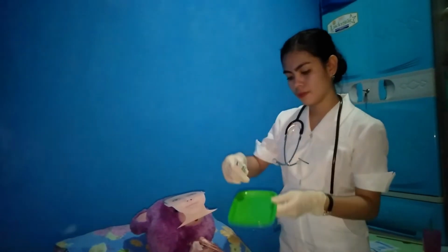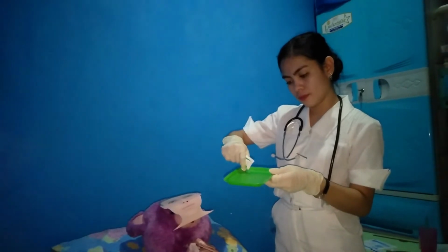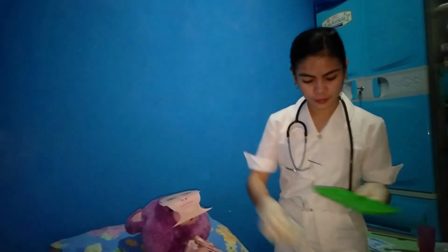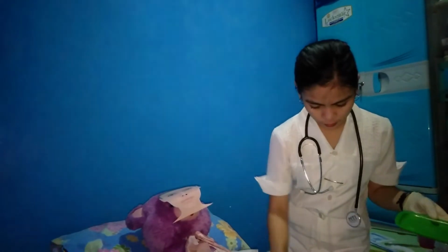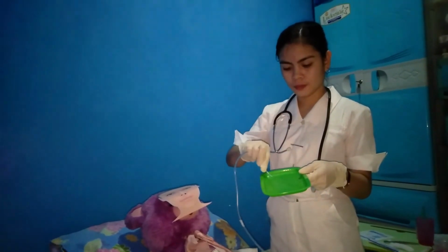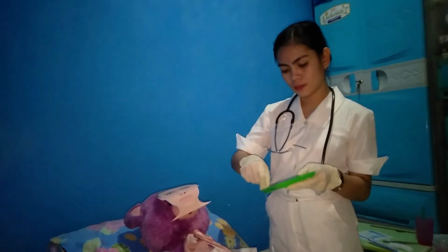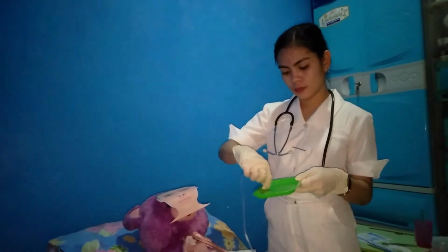Then next, we may need to insert the tube by first lubricating the tip of the tube well with the water-soluble lubricant, and then initiate the insertion at least 3 to 5 inches, and secure the patient's cooperation and facilitate comfort by instructing the patient to breathe.